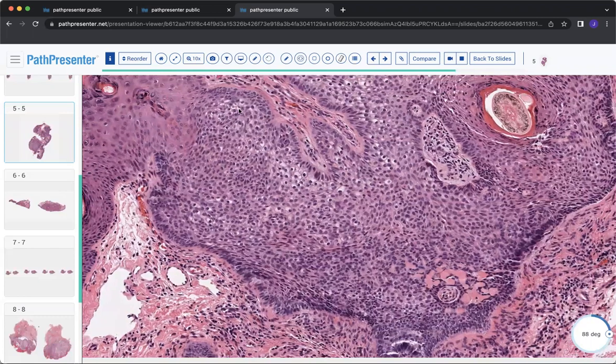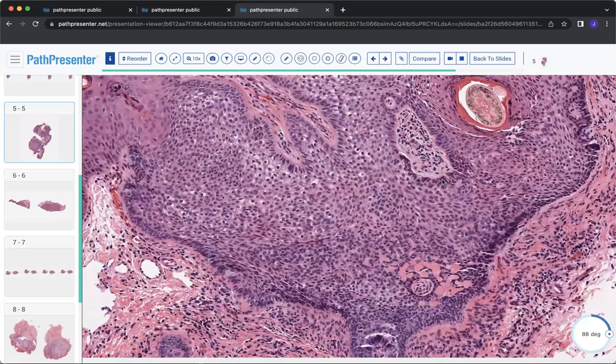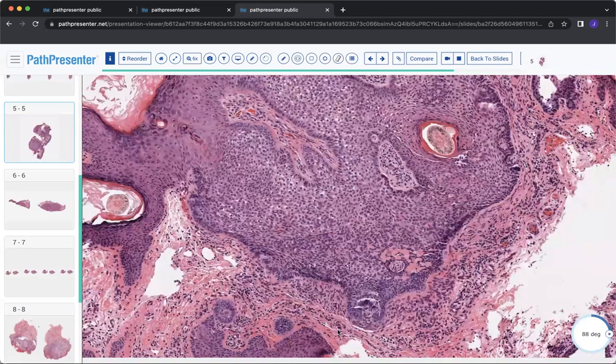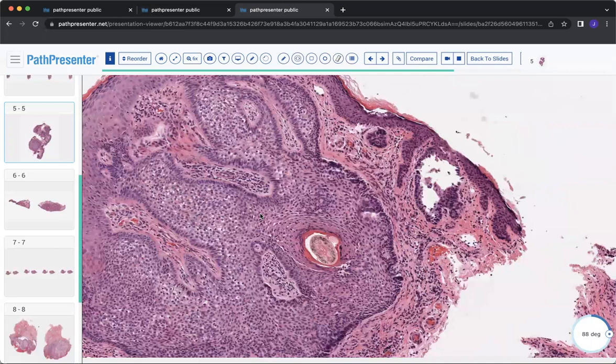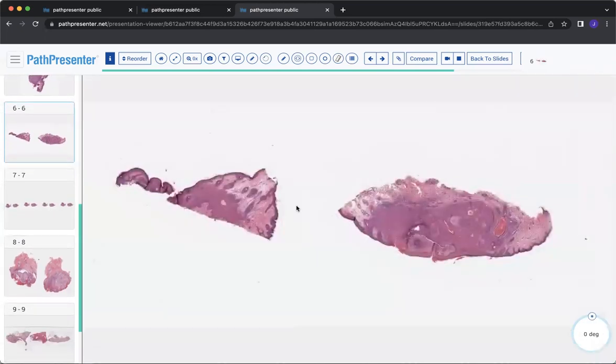So in this case, CD34 would be very positive in this whole area of clear cell differentiation. BerEP4 should be pretty negative. Sometimes you can see some focal BerEP4 positivity in more of the matrix bulb-like areas of hair follicles, but if it's not diffusely positive throughout the whole neoplasm, then that definitely helps support your suspicion that we're not dealing with any kind of basal cell here. So that's a tricholemmoma.